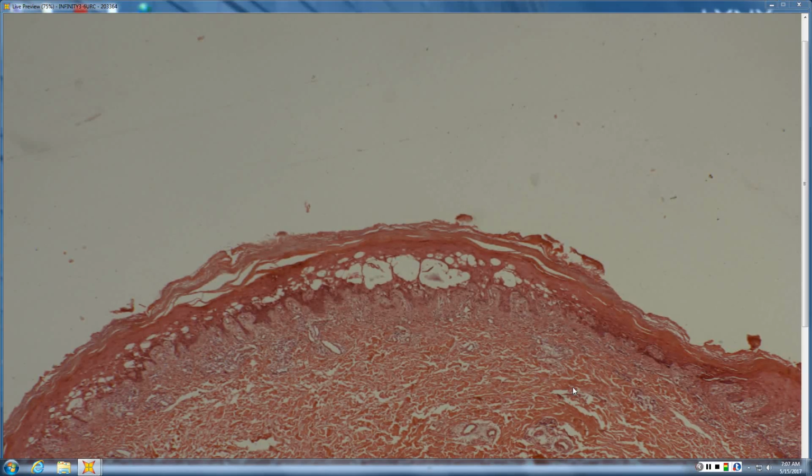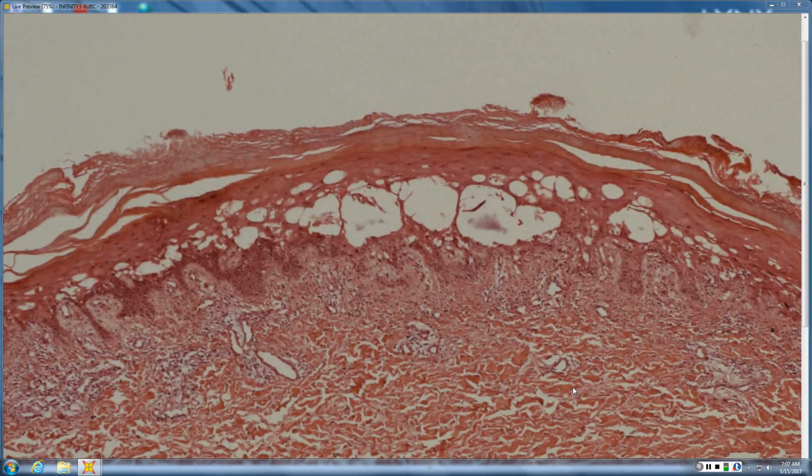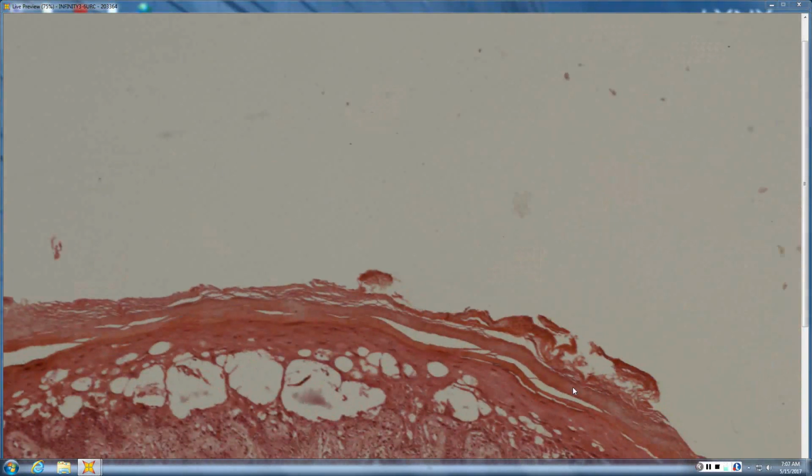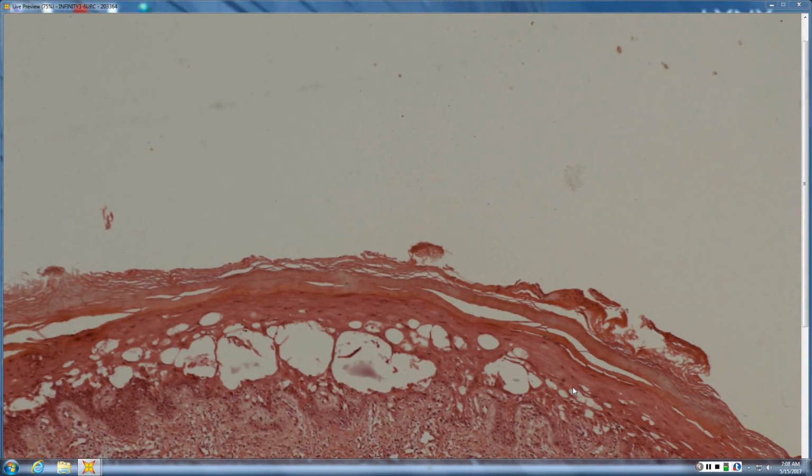This one was maybe acute to subacute because it is kind of a thickened horn in a sense. But because it's not chronic radiation dermatitis, you're not going to see the ectatic vessels or the stellate fibroblasts or that morphea-form change to the dermis. It's really just this sort of acute death of the epidermis. It's kind of like that sunburn.